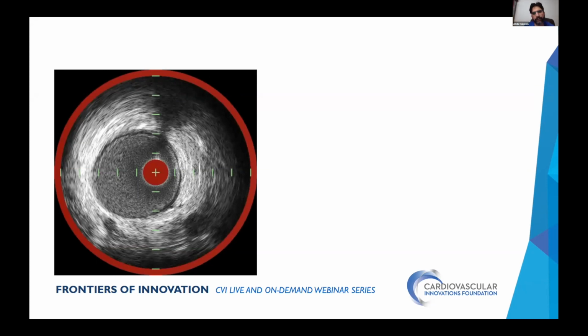So if, let's say, the FFR was 0.82, would you have done imaging or would you have just stopped there? Yeah, I probably would have done imaging.